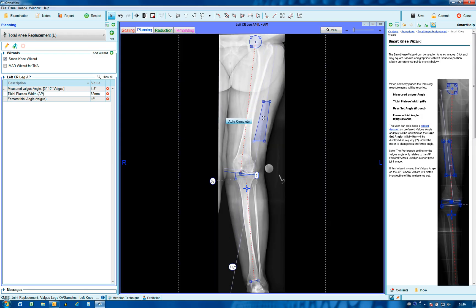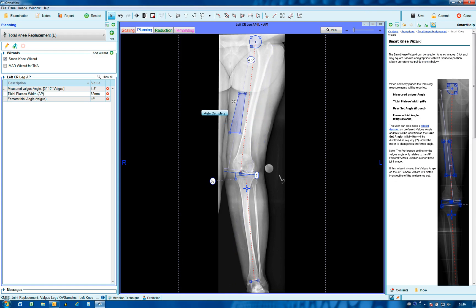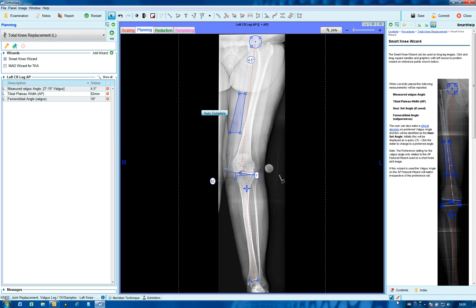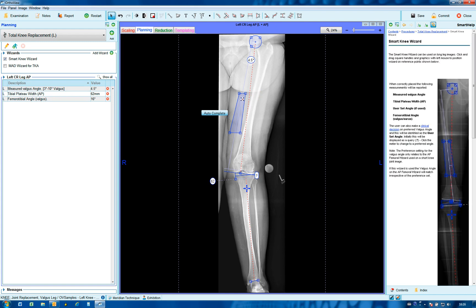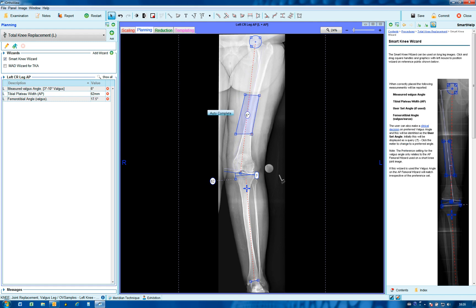In the case where you are manually positioning any rectangular box or perhaps the reduction tool, the snap-to feature can be engaged. A small red dot will appear on the screen when this is made available. As wizard handles are moved close to bony edges, the snap-to function engages and assists in the positioning of those handles, speeding up the planning process.